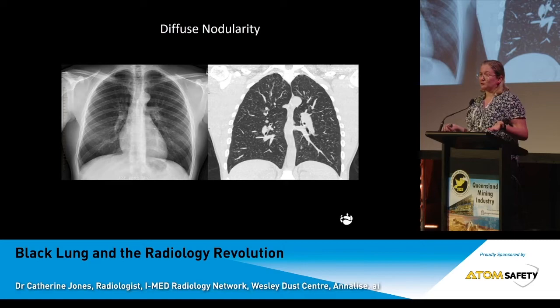The chest X-ray is normal. And the CT unfortunately shows hundreds and hundreds of these small nodules representing, again, those retained dust particles throughout the lungs.